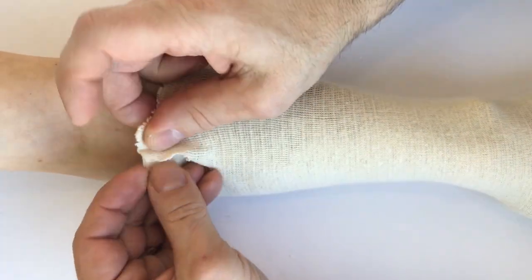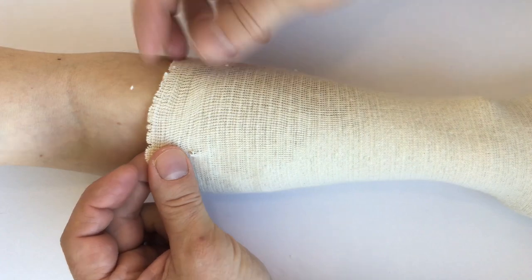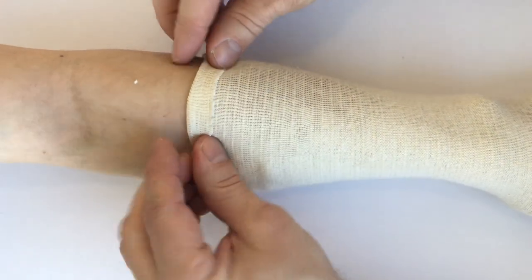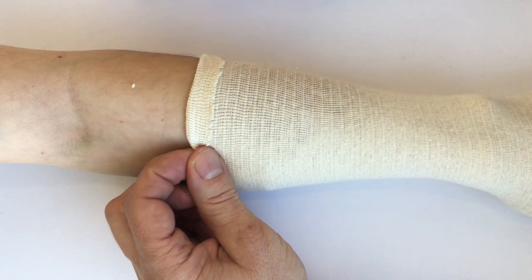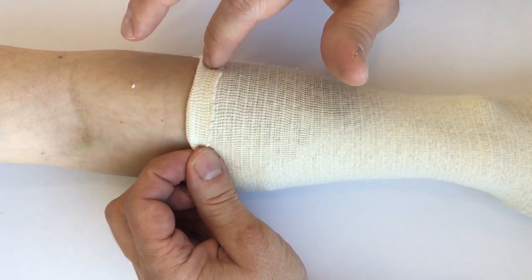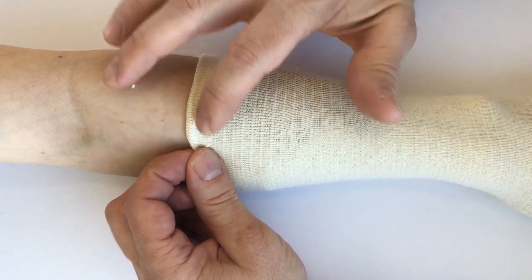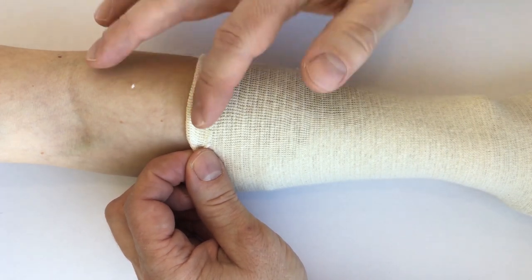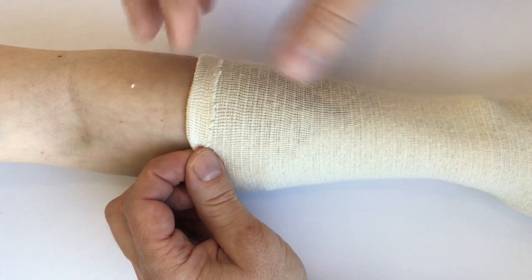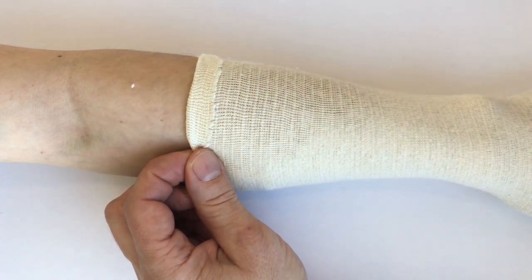One of the things that can happen if it's too tight more proximally is that it will roll over on itself as the client goes throughout the day. You really want to avoid that, because where it's rolled over it will create an area of higher pressure and more compression, which will actually hold the edema distally.